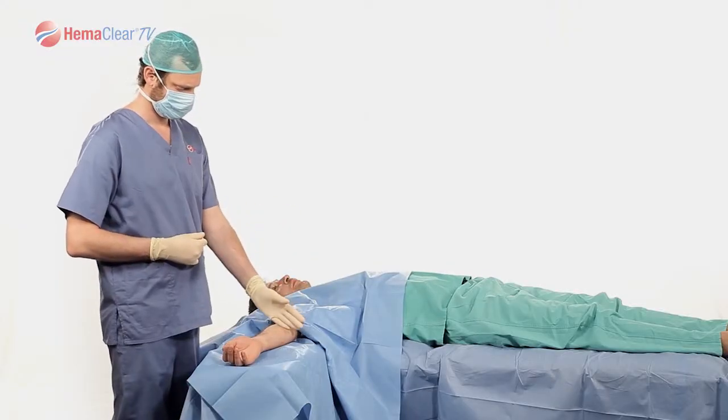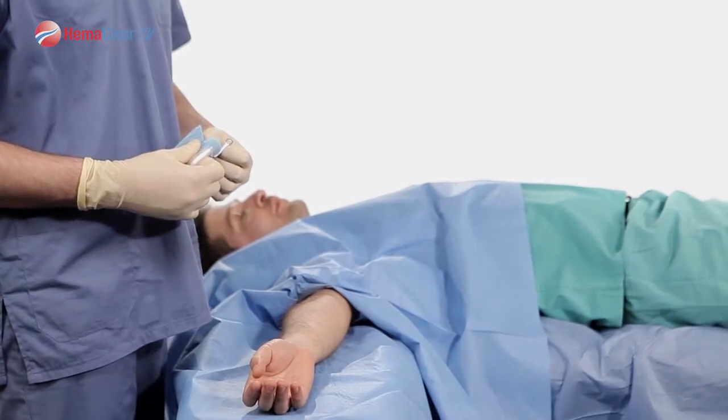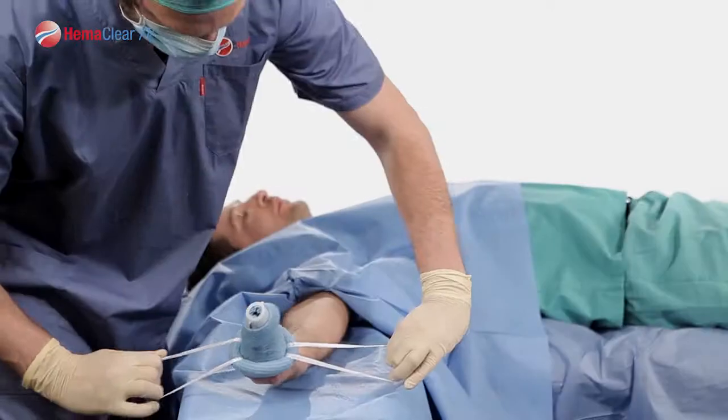You are now ready to apply the Hemoclear onto the patient. Instruct your patient to hold their fingers together, or have your assistant place all their fingers within the Model F cup.